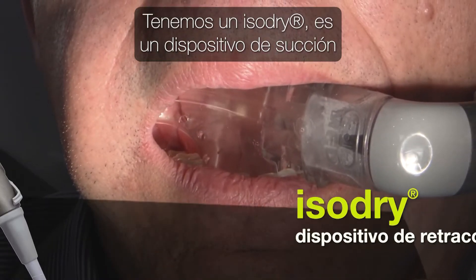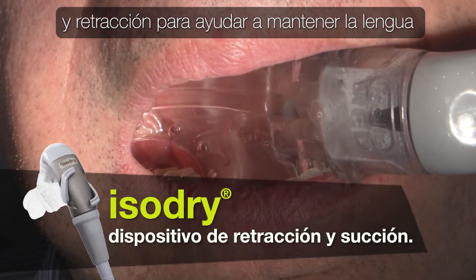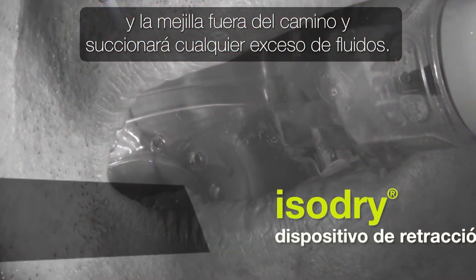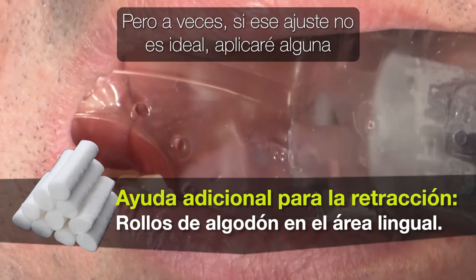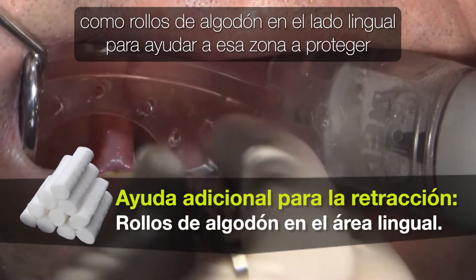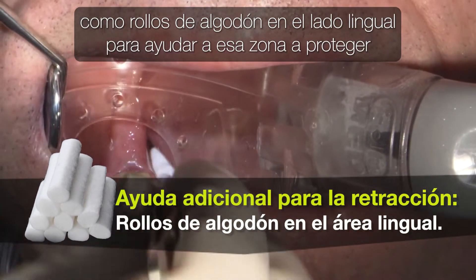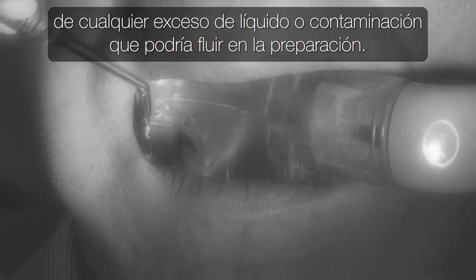We do have an IsoDry — it's a suction device and a retraction device to help keep the tongue and cheek out of the way, and it will suction any excess fluids. But sometimes if that fit isn't ideal, I will apply some additional retraction aid and maybe some moisture absorption aids like cotton rolls on the lingual side to help protect from any excess fluids or contamination that could flow onto the preparation.